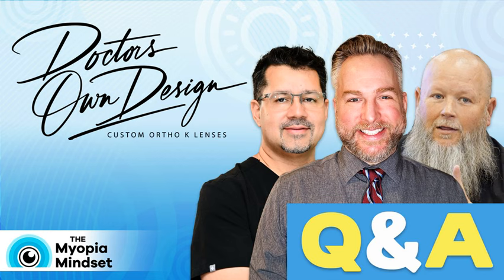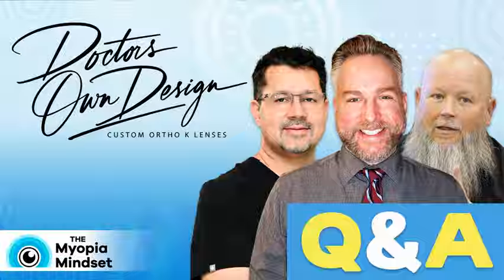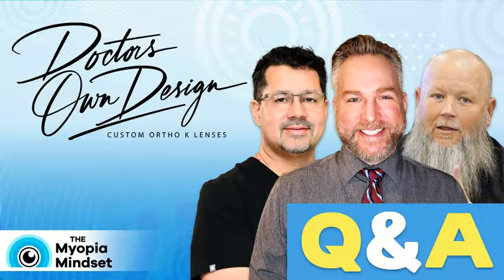Like me and Josh did one yesterday where he sent it over to me. He said, Mark, what do you think? And I said, oh, this lens is too big. It's a higher myope. They're getting no correction. I said, well, we're vaulting the cornea. We're not touching it at all. We need to be 0.4 smaller. He said, that's exactly what I thought. We sent out the new lens 0.4 smaller. That's the only way you can get something that's really not going to work. Otherwise, it's really hard to mess up.